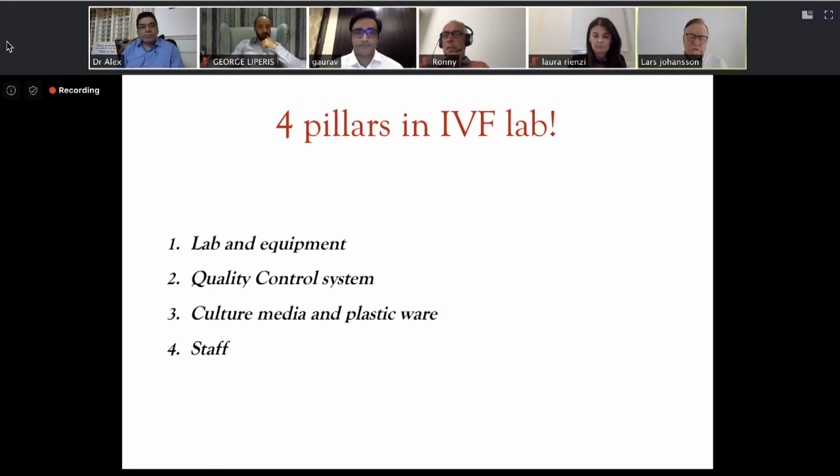Well, I would look into, first of all, if they changed anything with the stimulations, because it's not only the lab that is doing this. Probably not likely that they would have changed, because stimulations tend to go on in a similar fashion through and through. Then I would look into the temperature control, pH, but also the environment. I'm coming back to the environment a lot on this, because we know that delayed cleavage is also related to environmental problems, the VOCs again, but also sperm factors. They start affecting the embryo development later on in day 3, day 4.